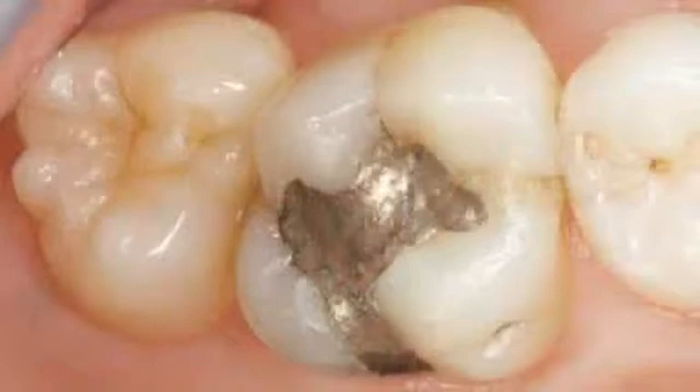Looking at the clinical preoperative view, there's an old amalgam that has decay around the margins, and there's a fractured area of the mesial marginal ridge as well as a fracture through the mesial lingual cusp. These factors are going to influence the way in which I'm going to prep this tooth. I plan to prep the old amalgam off and also remove the mesial lingual cusp, thus providing for an MOL onlay in the final restoration.